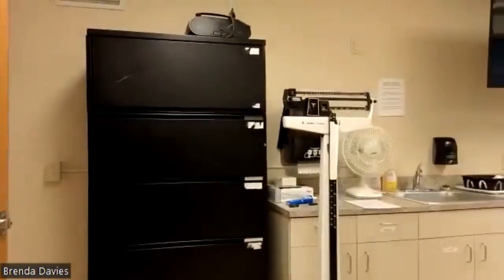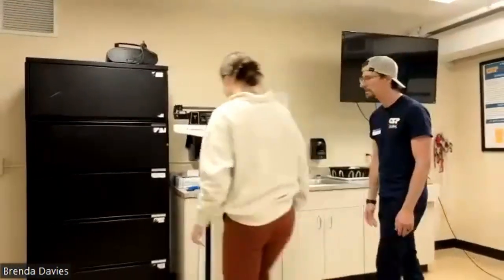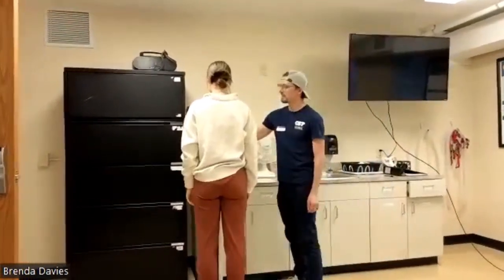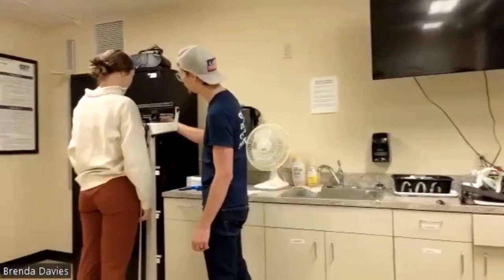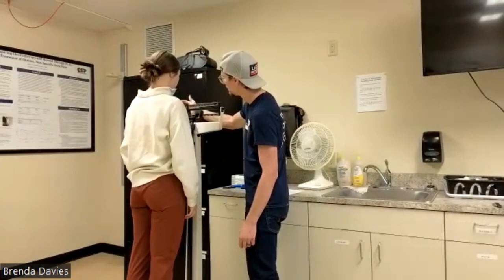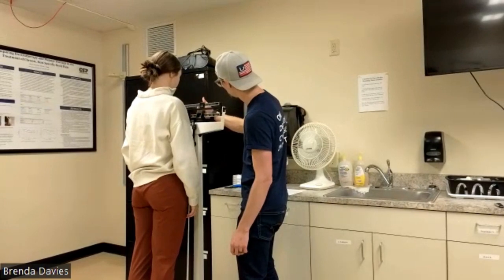Okay, so as we get the camera in focus, we're going to have Anna take off her shoes, and then we'll step up onto the scale. If you've never used one of these types of slide scales, you start with the bottom one first, and you go until you have this move to the bottom, and then you can slide the top one. Try and get it right in the middle.